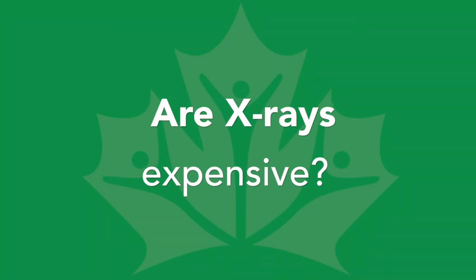However, once every 5 years, it is recommended that we take a full series of X-rays to check absolutely everything. And the difference would be, for instance, having a complete physical versus going for a quick visit to your doctor for something specific. And when it comes to the cost, of course, the more that we take, the higher the cost. So what we want is the maximum amount of diagnostic information for the fewest amount of X-rays taken. And we have to balance those things depending on the individual's needs.